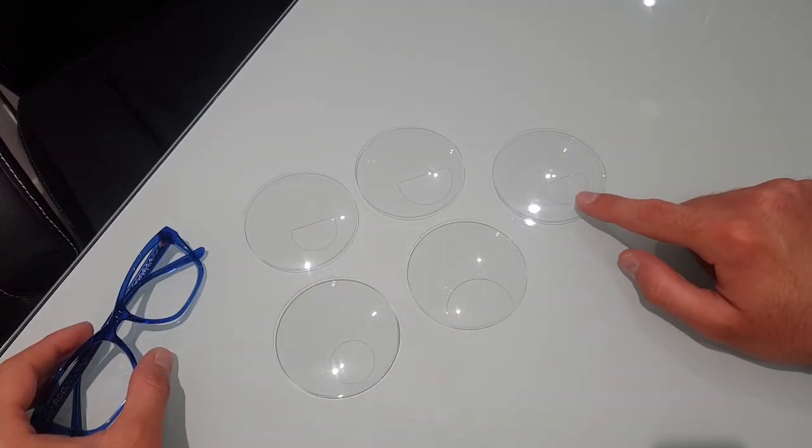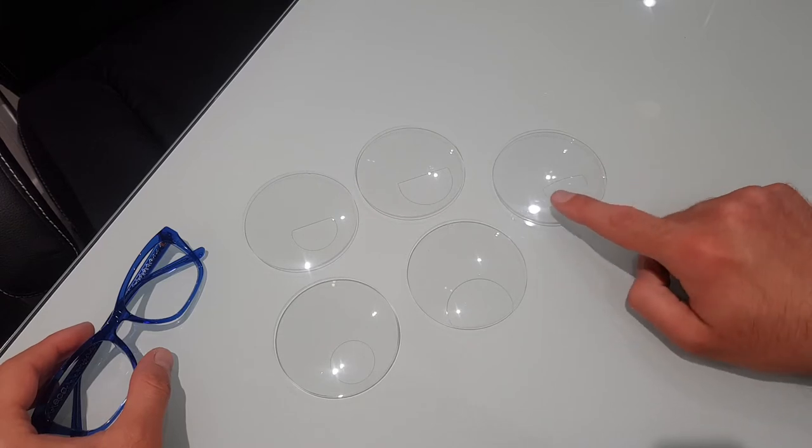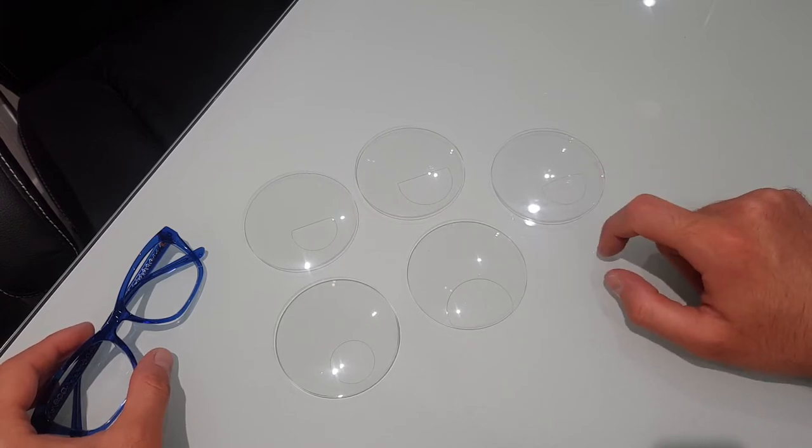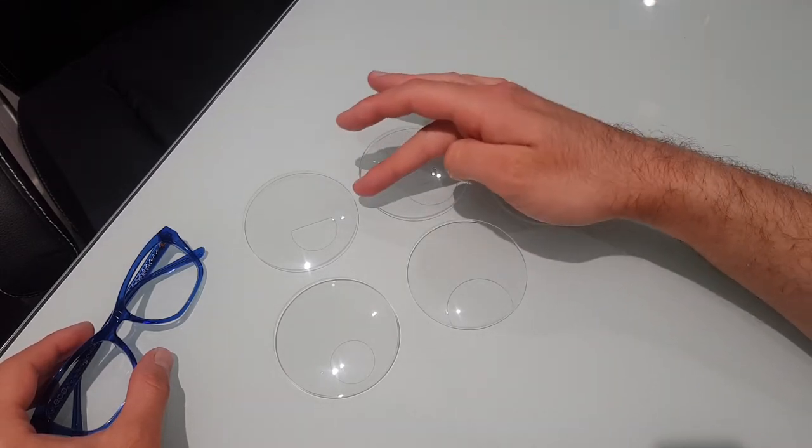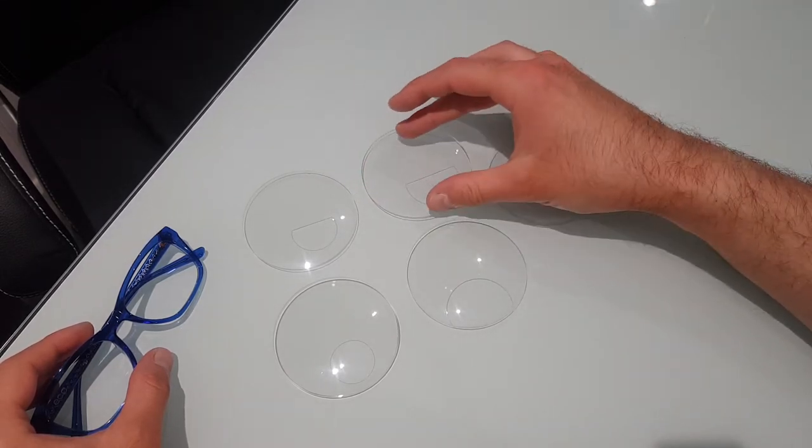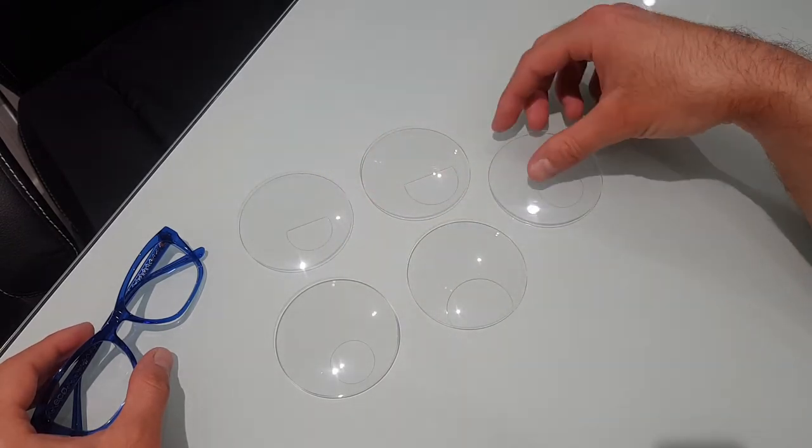This one here is called a C28 for a curved top, and that again is 28 millimeters across the top. You can get other bifocals as well where you have the reading section that goes across the whole lens, but that's not as common as these five here.